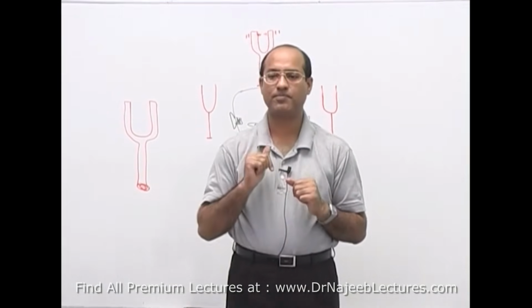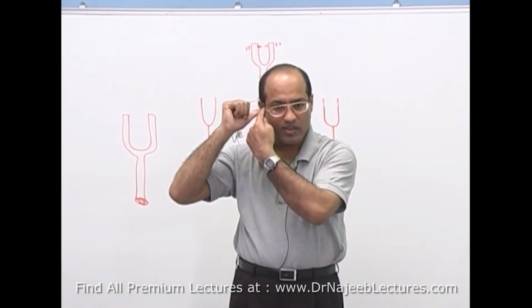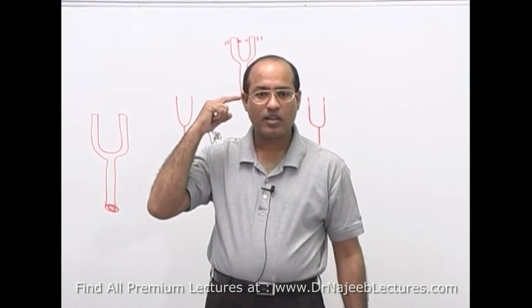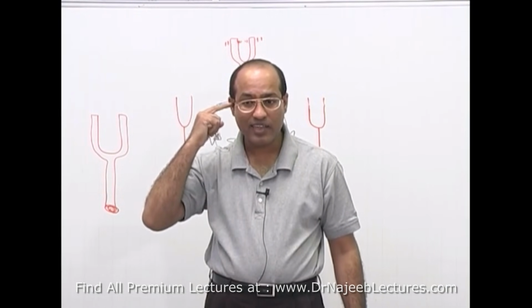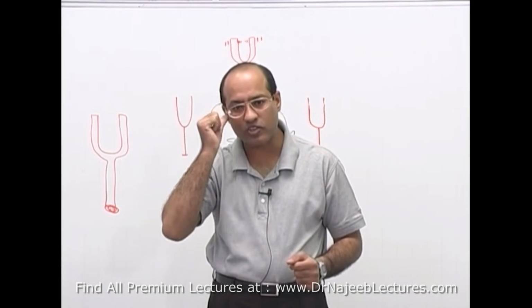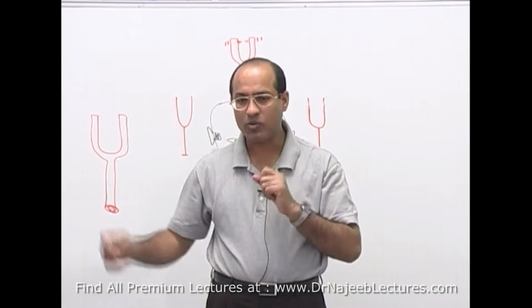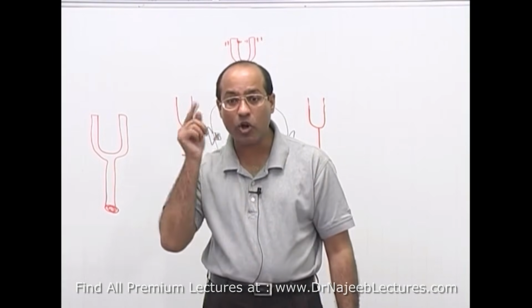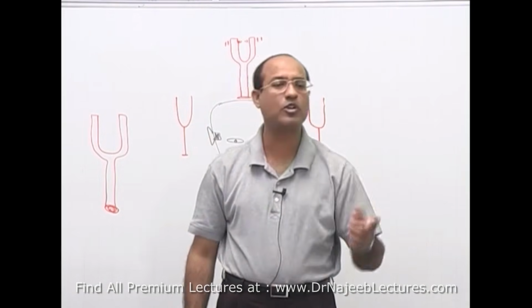Now the second person comes. He lateralizes the Weber to the right side. Now what do you do? You do Rinne's. In that case, on the right side, air conduction is less than bone conduction. It means he has conductive deafness on this side. Now another patient comes. Again Weber lateralizes to this side. Now he has either a conductive problem here or sensory neural deafness on the other side. What do you do? You test bone conduction and air conduction. He has air conduction longer than bone conduction. It means there is no conductive deafness here. What should be diagnosed? Sensory neural deafness on the opposite side.